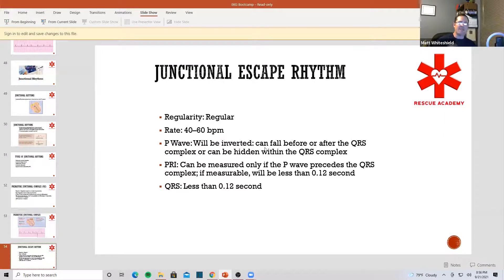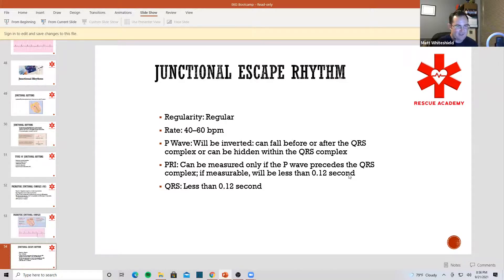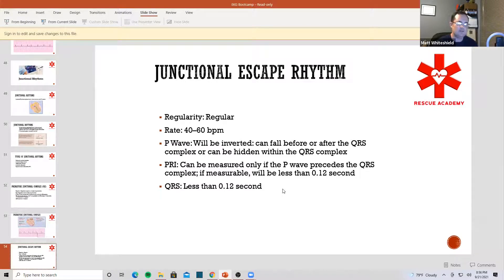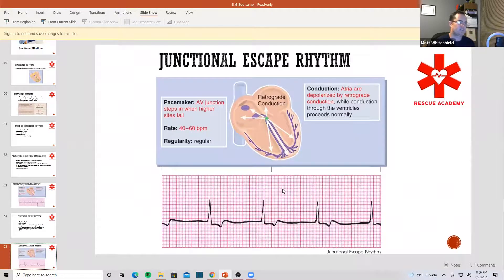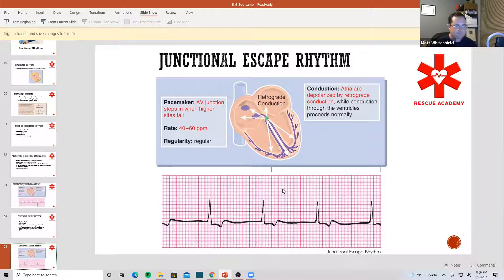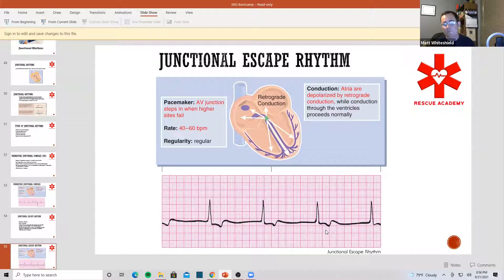The intrinsic rate of the AV junction is 40 to 60, so this is a regular junctional rhythm at 40 to 60. The P-wave is either going to be inverted or hidden within the QRS complex. The PRI can be measured only if the P-wave precedes the QRS complex — it will be less than 0.12 — and the QRS is still narrow. Looking at this junctional escape rhythm, the rate is about 40 to 50, there are no P-waves, narrow QRS complexes — has to be junctional.